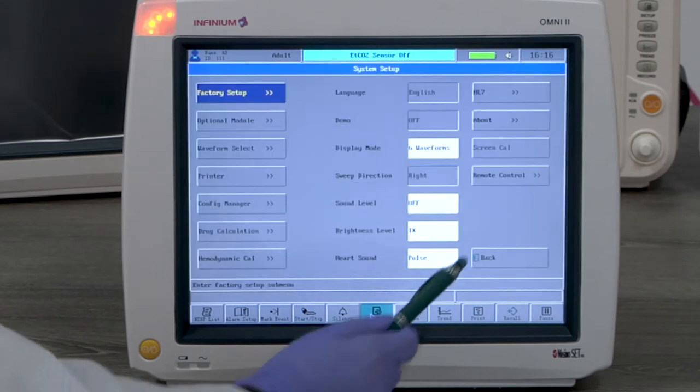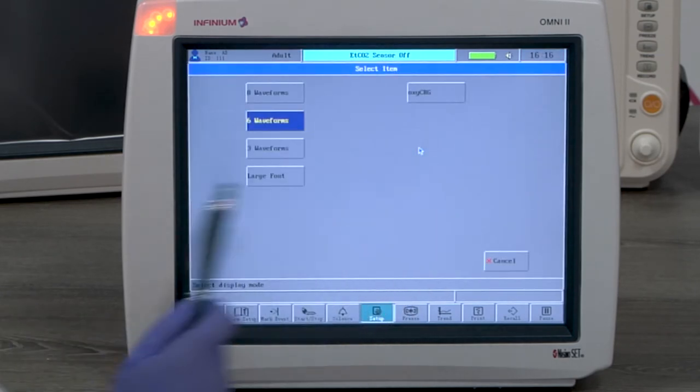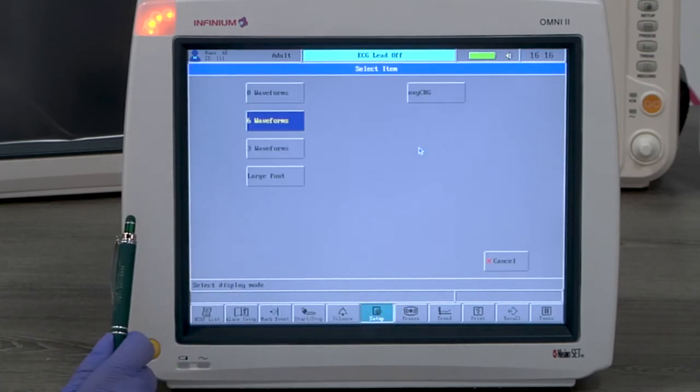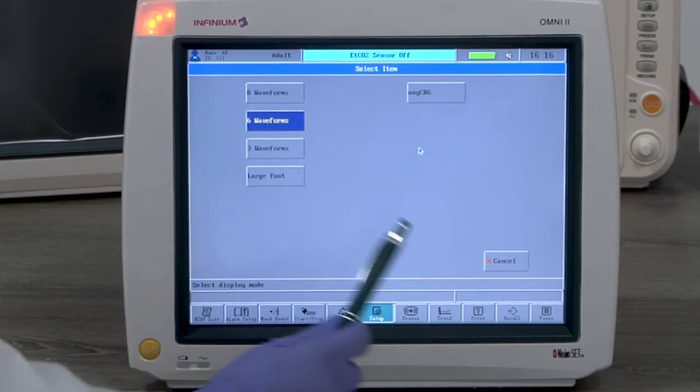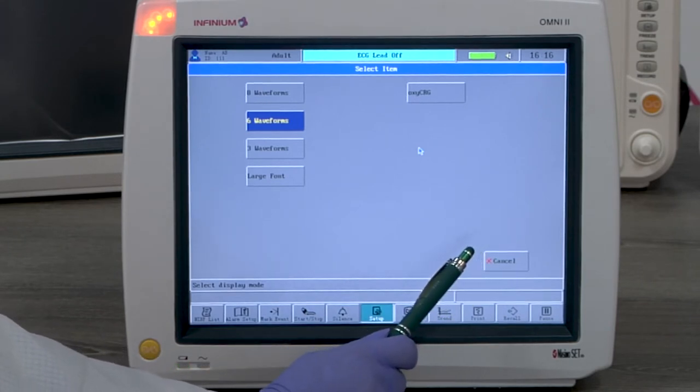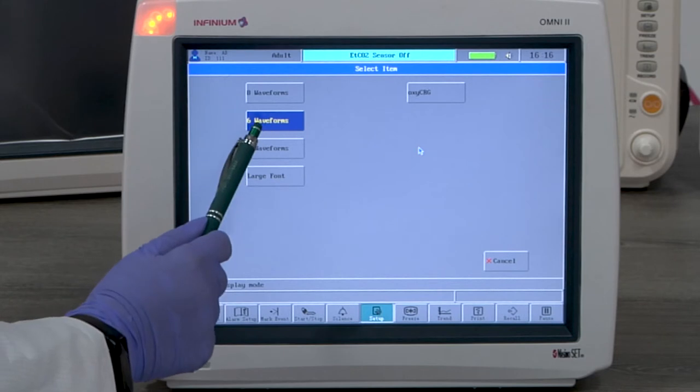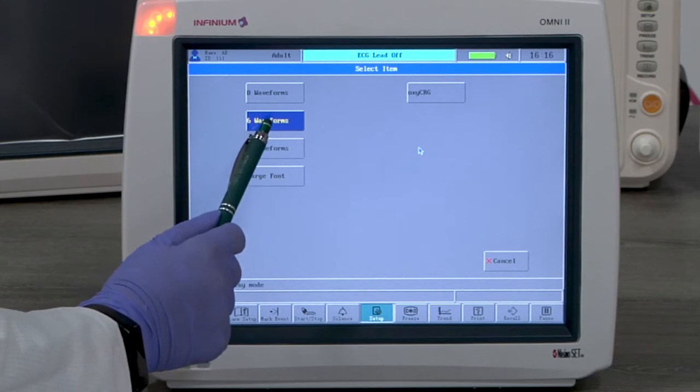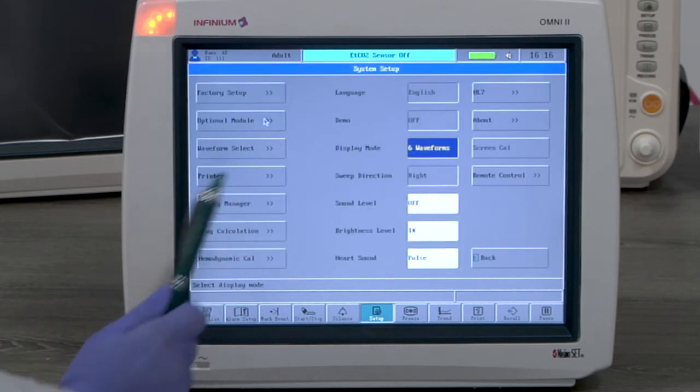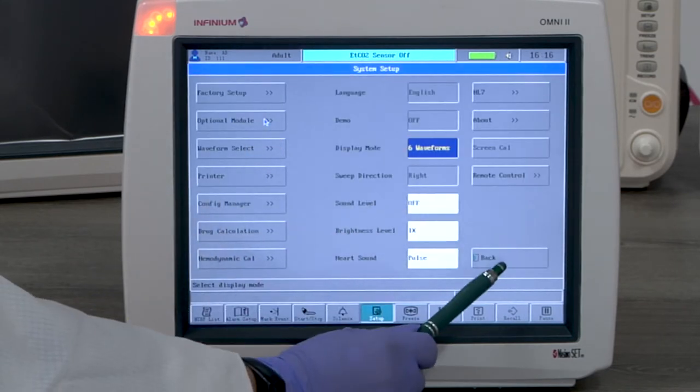Waveform display. Go to setup menu, display mode, and then select according to your preference. We have 5 display modes: 3 channel, 6 channel, 8 channel, large font, and OxyCRG.